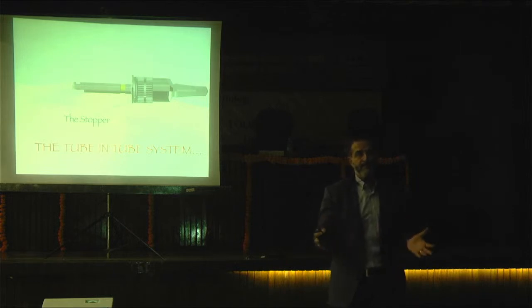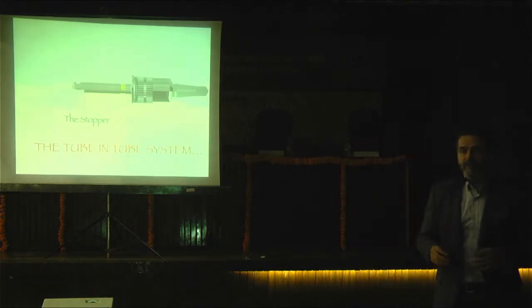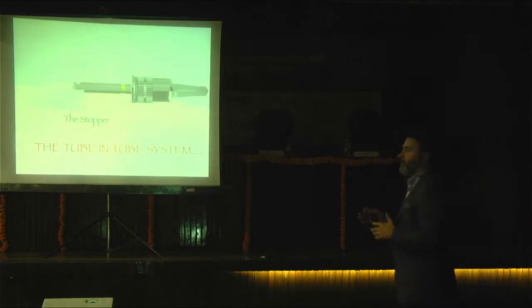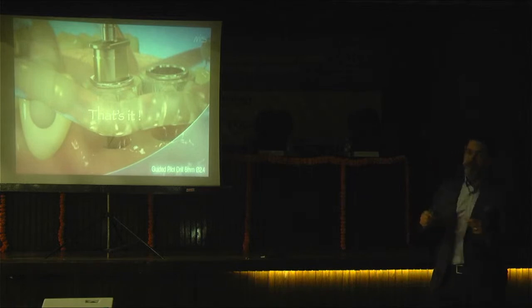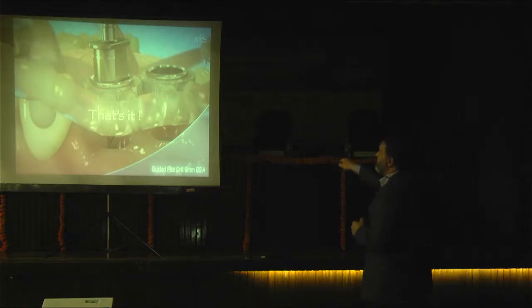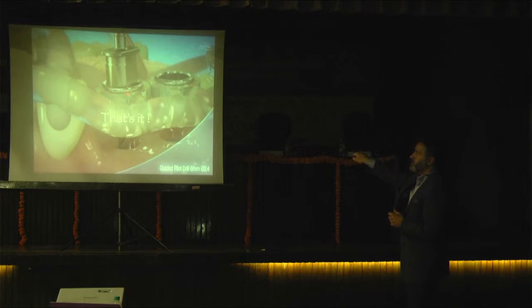There are so many guide systems, but the best, I'm not telling you about this brand. I'm telling about the system. The tube-in-tube system is the best option for guide systems. So when we place the guide on top of the tooth and the edentulous part, and when you start drilling, this is the tube and sleeve, what we call sleeve. This is the tube in the drill, and it goes and stops here.